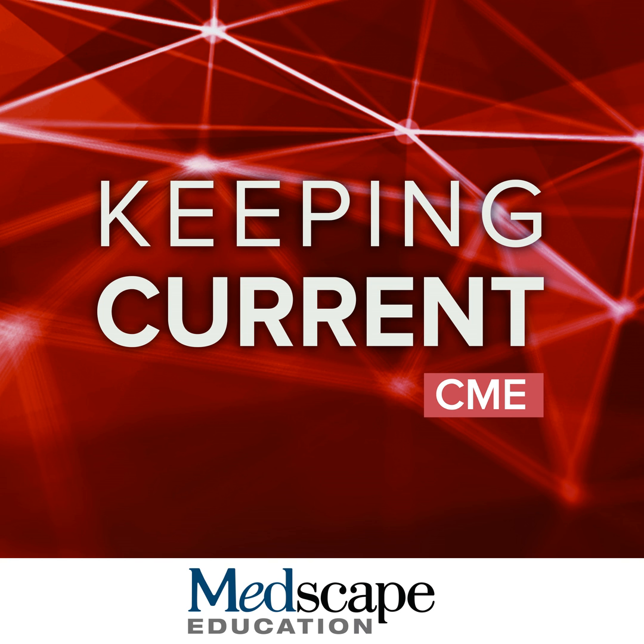This patient also had ARIA-H, and we're showing here on the top the T2 FLAIR, and on the bottom the GRE. So again, post-dosing when the ARIA-E was identified, there were a few new microhemorrhages. The next time point, we had progression of ARIA-E and also progression of ARIA-H with more microhemorrhages.